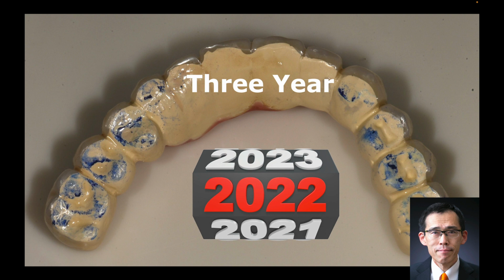After 3 years, the occlusal surface is PEEK, but no major wear is seen. Polishing of the antagonist prosthesis is essential. I have seen PEEK wear due to lack of antagonist polishing.